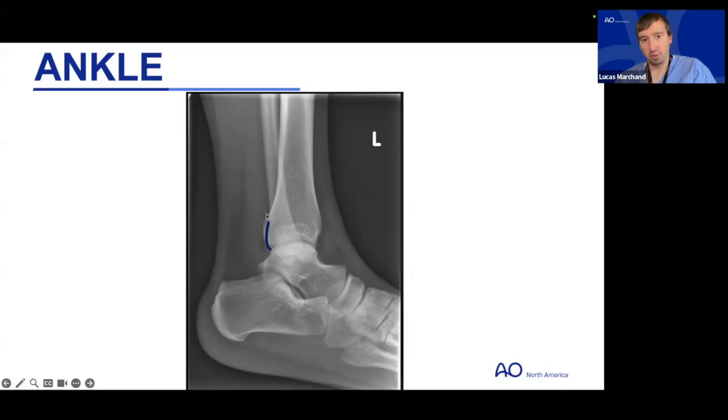That posterior border of the fibula should really transect where the articular margin of the distal tibia meets the non-articular margin of the posterior malleolus. That can have clinical implications anytime somebody has a syndesmotic injury and you're in the process of putting the fibula back to the tibia in an anatomic position.